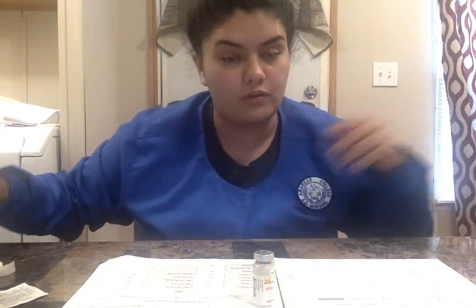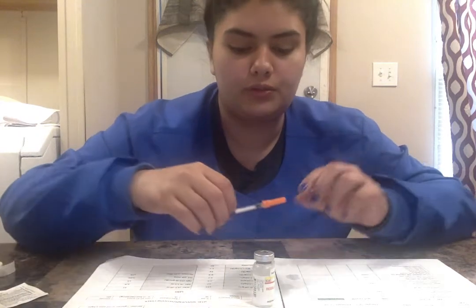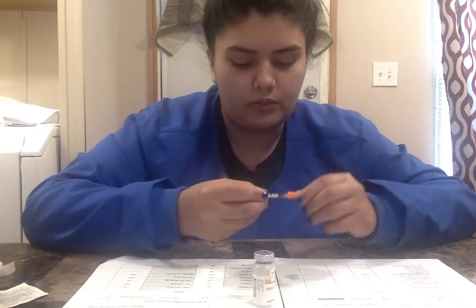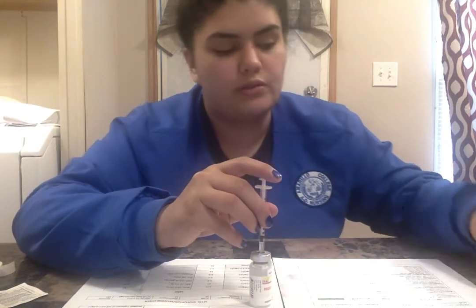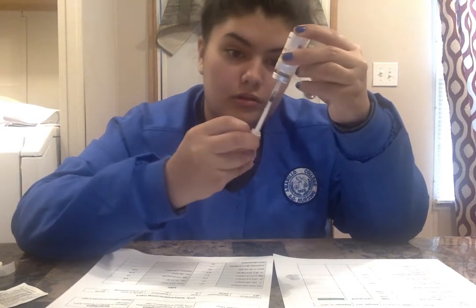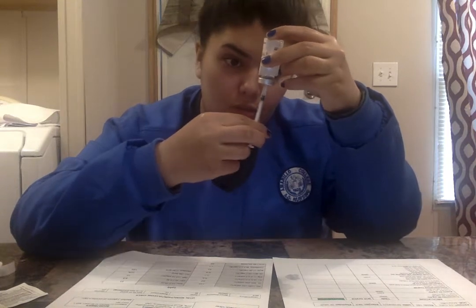We have called our nurse over so that she can do the 2-nurse check with us. We're cleaning the top of this vial with an alcohol pad. We are going to pull up 2 units of air because this is a multi-dose vial. We're going to open our needle. We're going to inject the air. We're going to invert the needle. We're going to draw up 2 units. So that is 2 units, and there is no air bubbles.